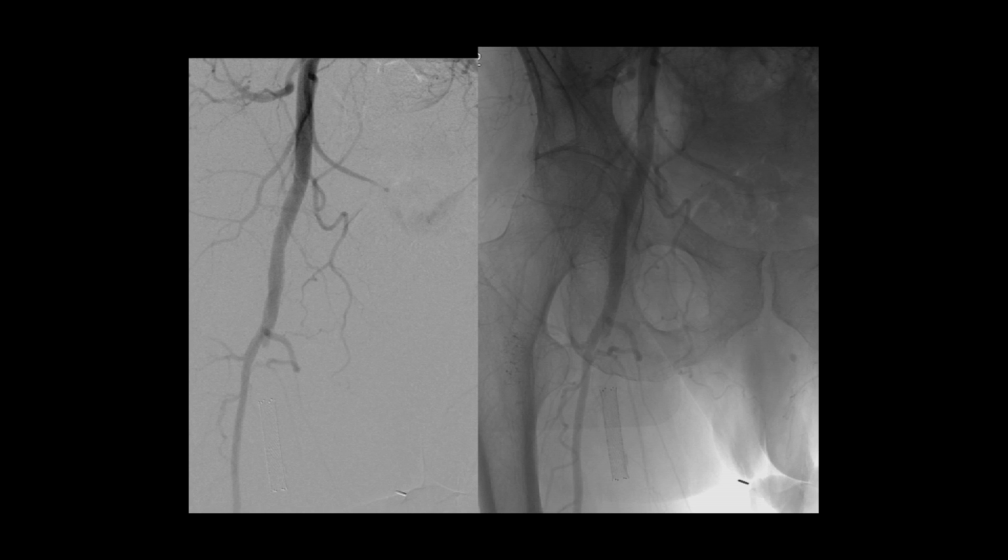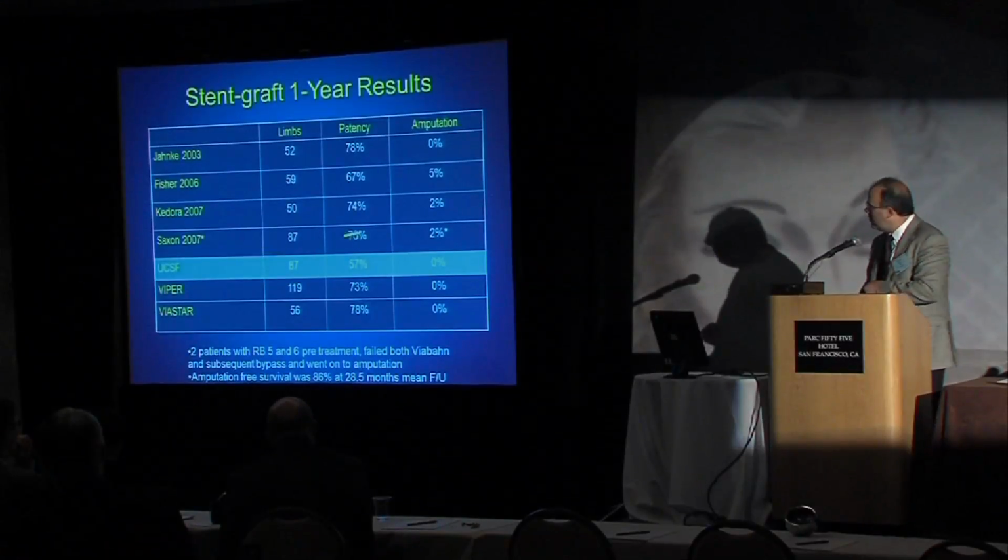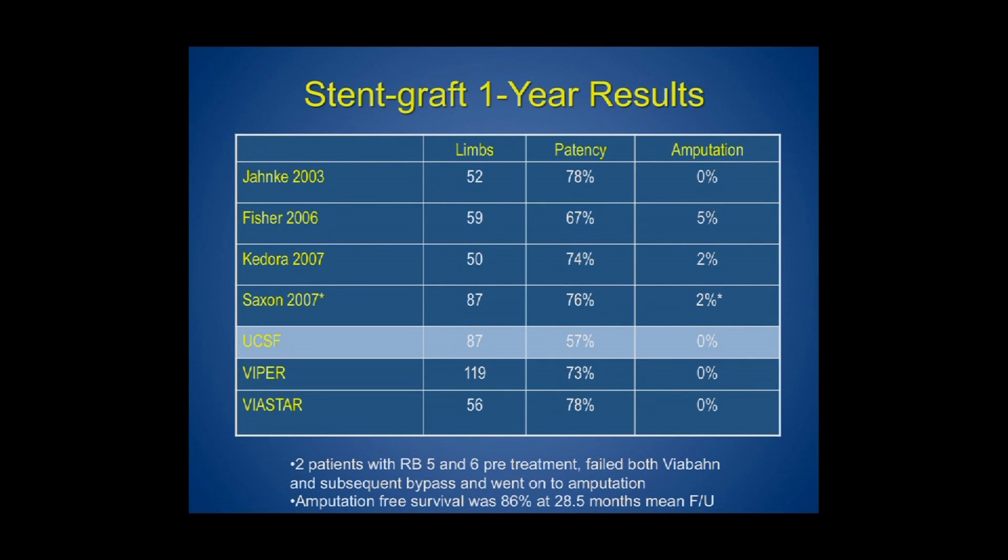Okay? And what he did was he thrombosed this and for some reason occluded his whole SFA and embolized to his trifurcation. And those are the stent graft patients that I see that come back with acute ALI, is you're treating extensive disease. If it goes down and it embolizes, you've got acute limb ischemia. But that happens with bare metal stents when you're treating extensive disease as well. But do you end up with amputations? I don't think so. I think it's treatable and the patients do well.